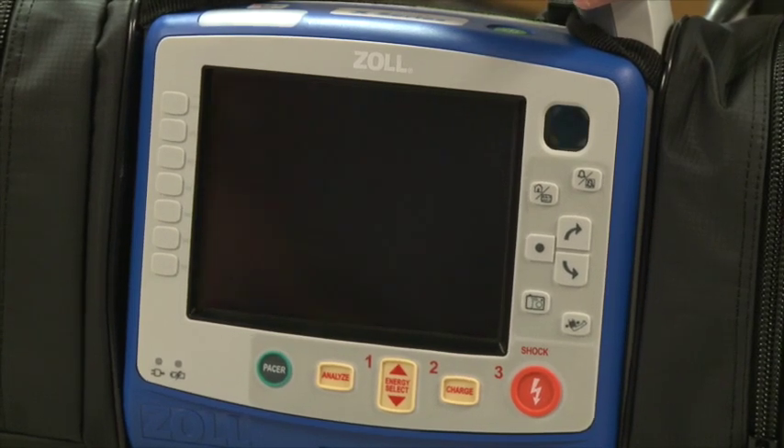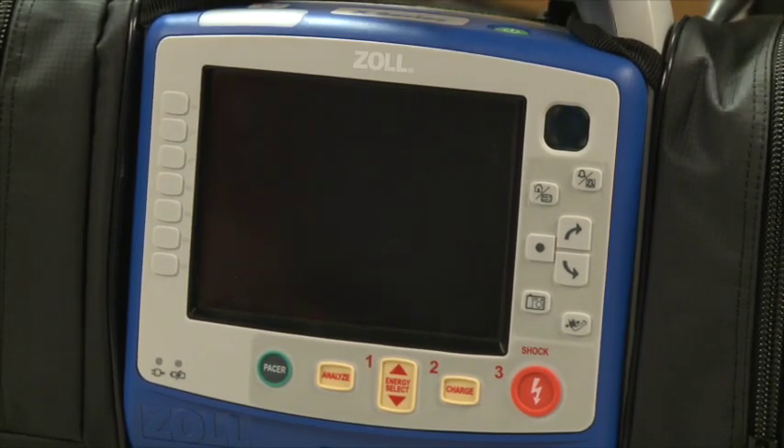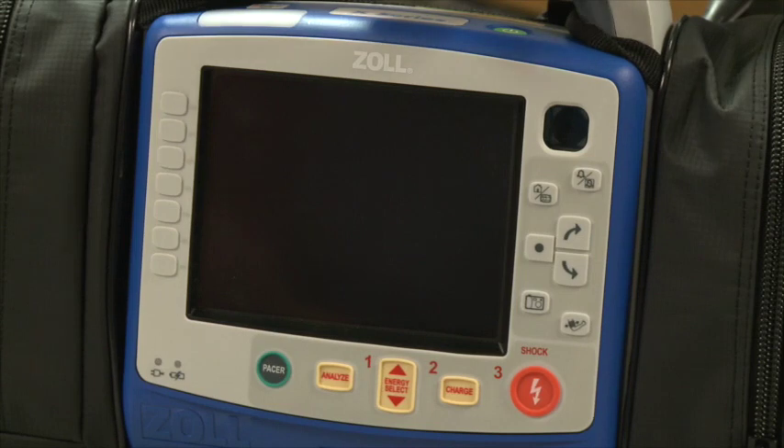Hello, I'm Randy with Zoll Medical. Today we're going to go over the X-Series. Please ask questions as we go. The goal of today's session is that after we're done, you're able to deploy the devices and use them in the field. There are some online modules available if you'd like any follow-up training that Beth and Chris have access to. I'm always available as well — feel free to call, email, or text me.